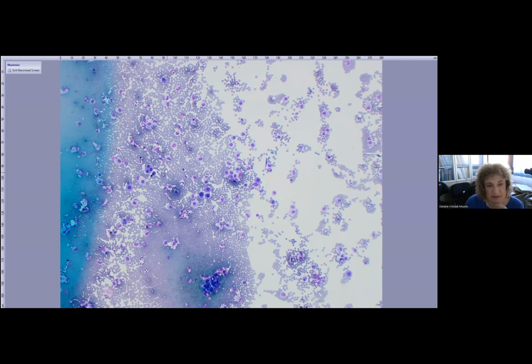Great points. Yes, but we use it more frequently in the pleural fluids and in the pulmonary cytology, more frequently than in ascitic or peritoneal fluids. Sure. Because we have situations with thoracic or pulmonary tumors where the only material that we will have in the future would be cytology material. Brilliant. FNAs or brushes or effusions. So absolutely, we are especially careful when we have pleural fluids.